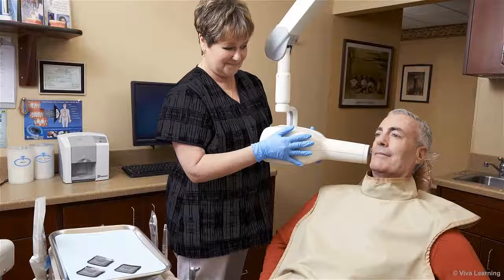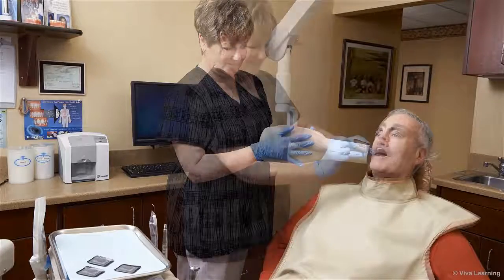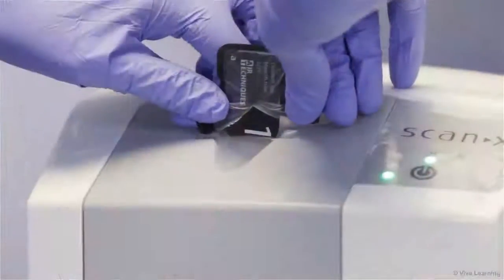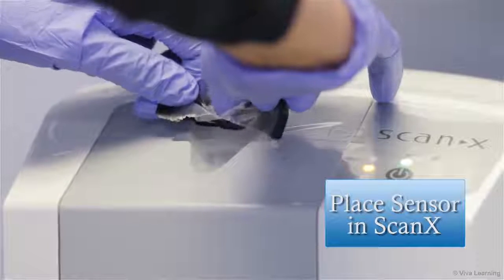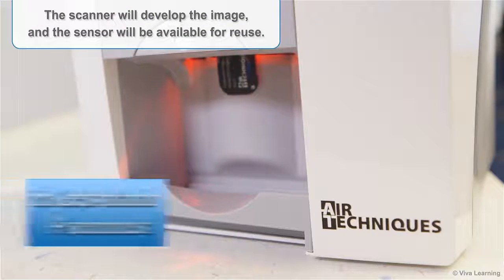Producing immediate chair-side radiographs is as easy as 1, 2, 3. First, remove the sensor from the patient's mouth. Next, remove the sensor from the infection control barrier and simply drop it into the slot on the scanner. That's it! The scanner will develop the image and the sensor will be available for reuse.